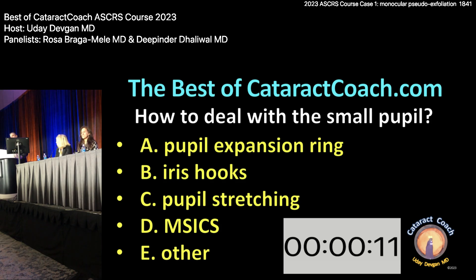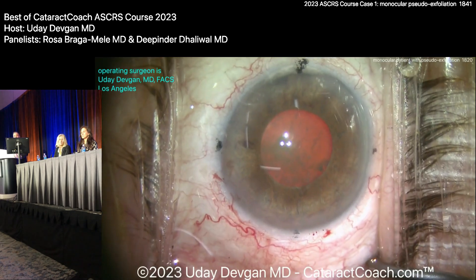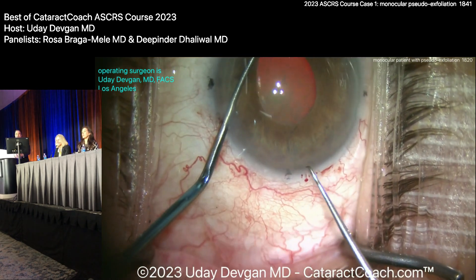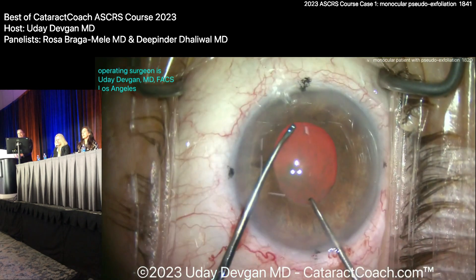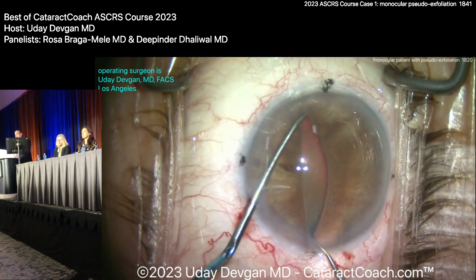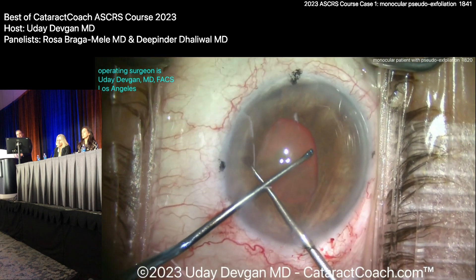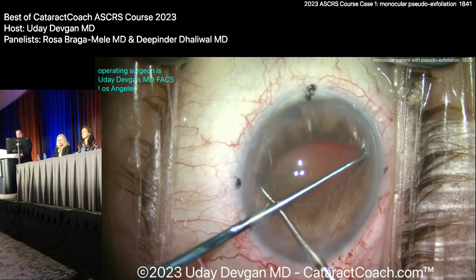You guys aren't going to like me because I didn't take any of your advice. It's going to be a rough morning. Here's what I did. I didn't want to do a ring, hooks, or SICS. So I just stretched the pupil out. I got a chopper in one hand and a Sinsky in the other, and I'll stress the pupil a little bit. All of this is at high speed — I'm really not this frantic when I approach. So it stresses the pupil out and that's kind of enough.